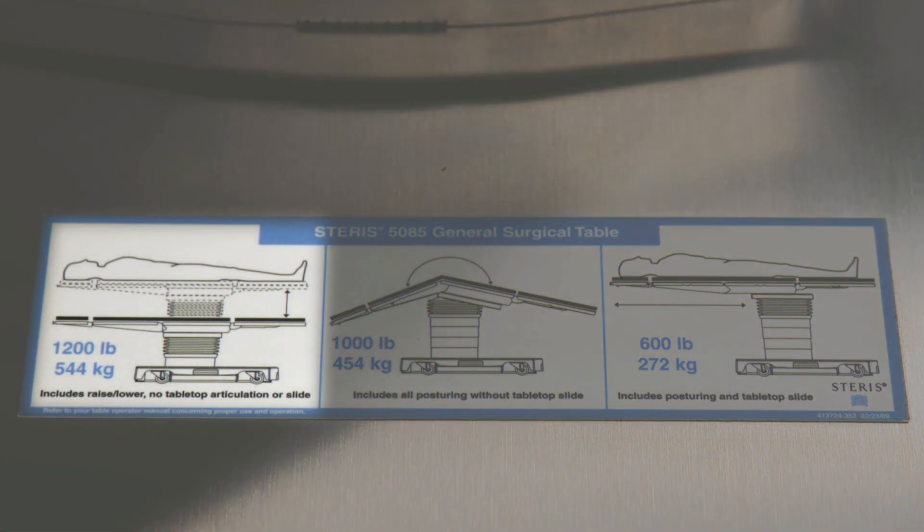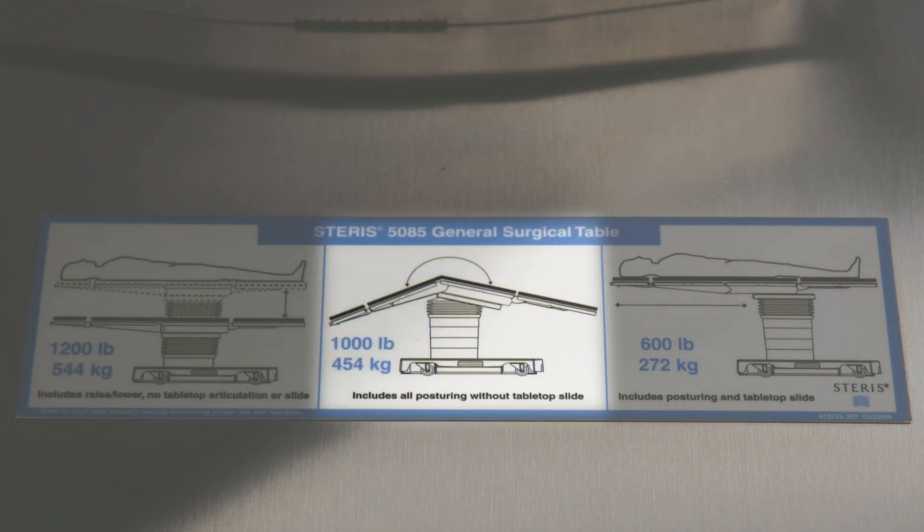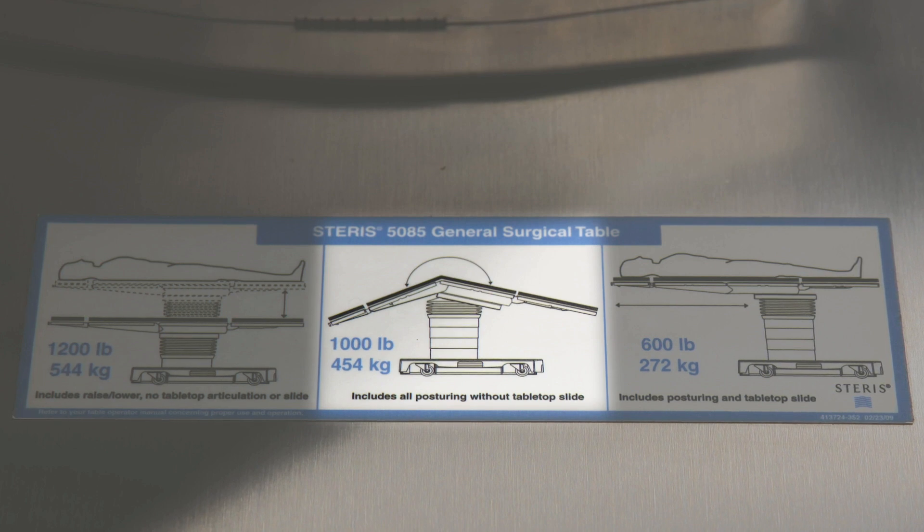The first number is 1,200 pounds — you can move the surgical table height up and down with the patient on it up to 1,200 pounds. The more important number is the middle number: 1,000 pounds weight capacity. That includes full articulations, including Trendelenburg, reverse Trendelenburg, lateral tilt left and right, flex and reflex, and kidney bridge.